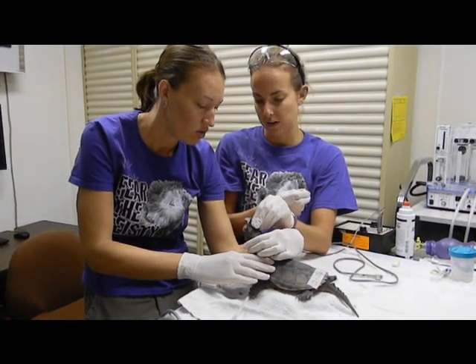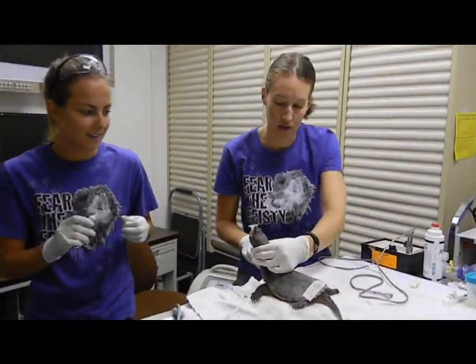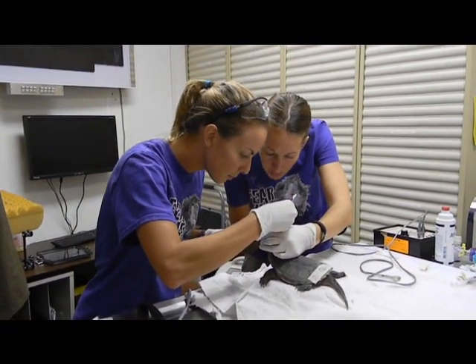I'm going to move his eyes first. Do you want me on that side? Yes, I do. And then I also, once you have his head, I just want to clean up that little spot. He's still a little funky.